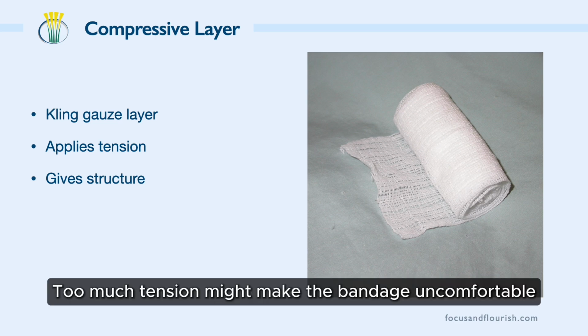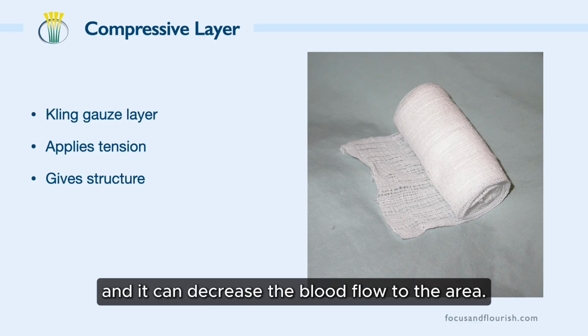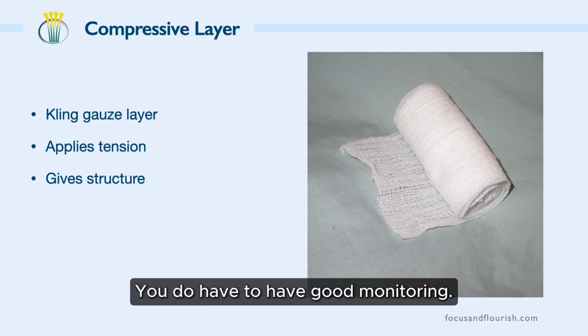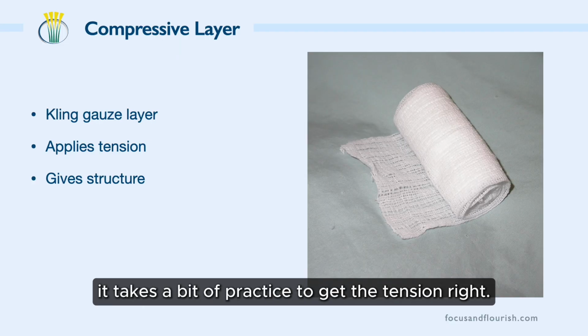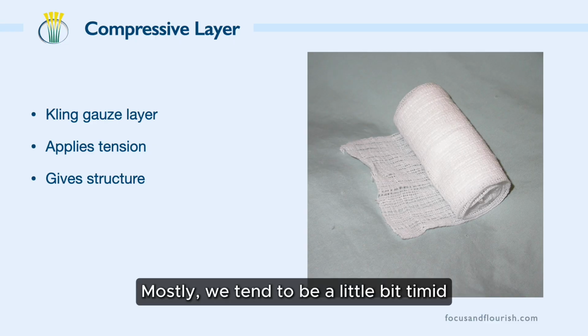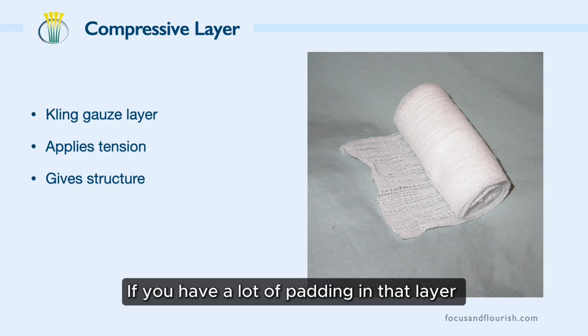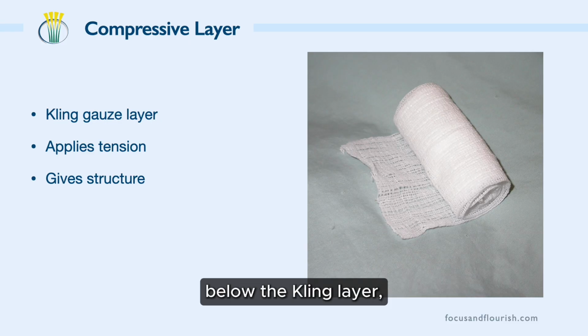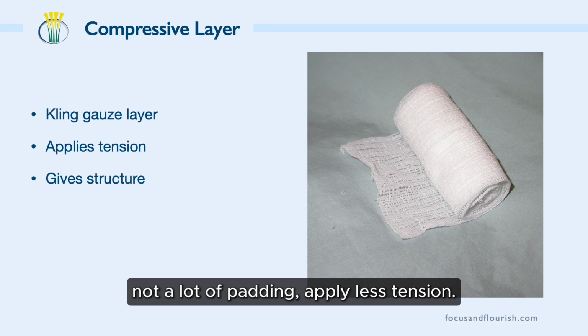Too much tension might make the bandage uncomfortable to the patient, and it can decrease the blood flow to the area, so you do have to have good monitoring. You have to be patient with yourself. It takes a bit of practice to get the tension right. Mostly, we tend to be a little bit timid and not apply enough tension. If you have a lot of padding in that layer below the cling layer, then you can apply a lot of tension. Not a lot of padding, apply less tension.